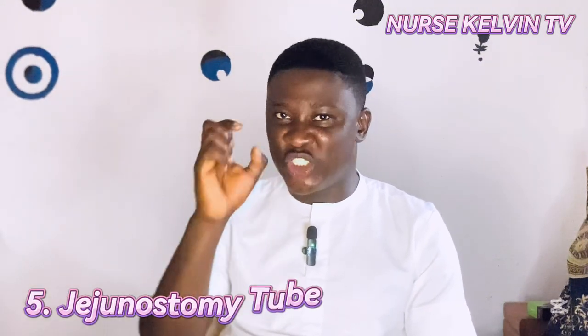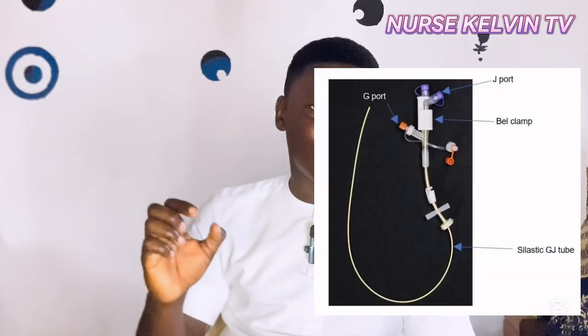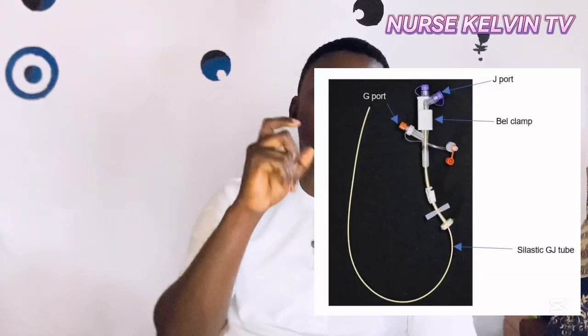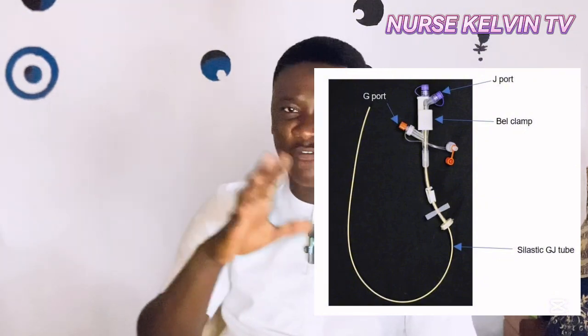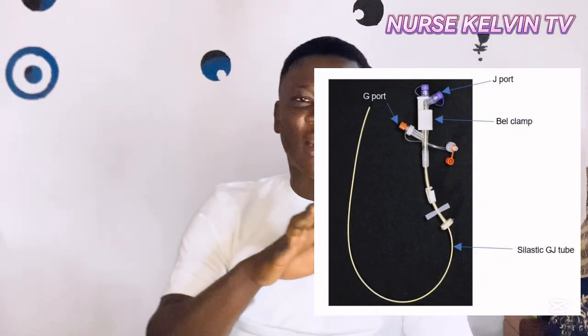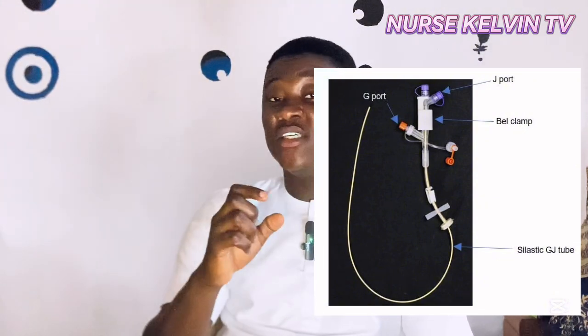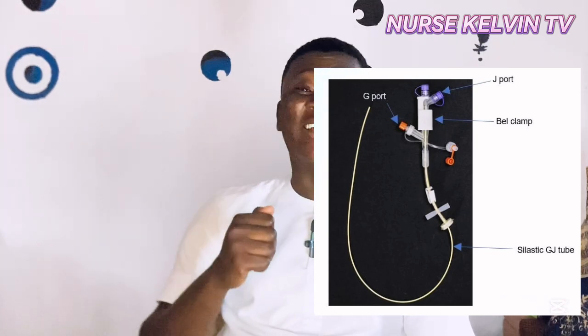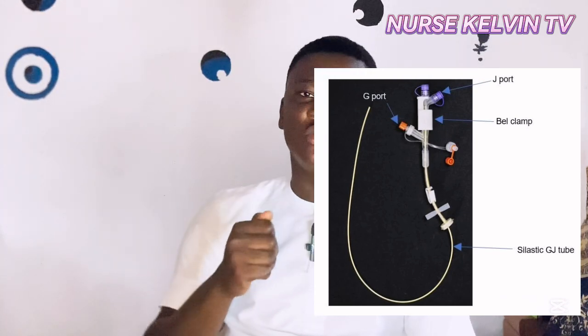Then the last one that we are going to talk about is the jejunostomy. When we talk of the jejunostomy tube, or the J tube, this tube is used when the stomach cannot be used for feeding. So when the stomach cannot be used for feeding, we pass this tube, known as the jejunostomy tube, into the patient.